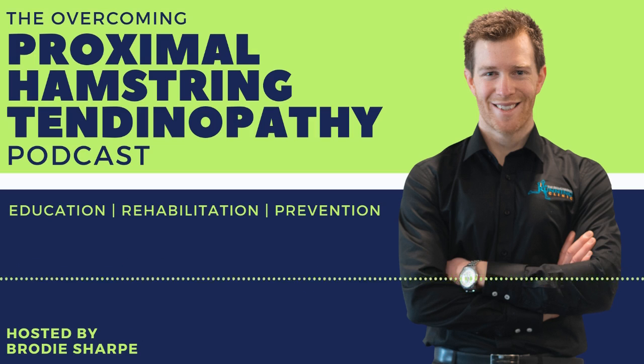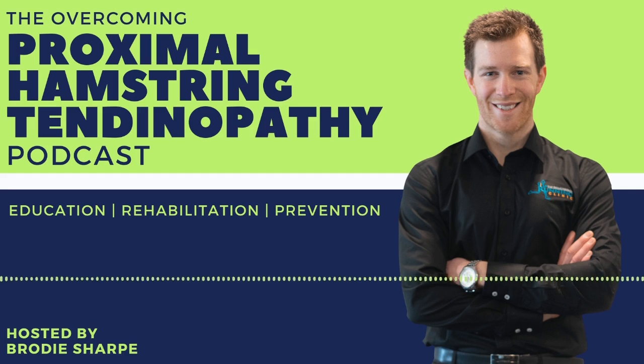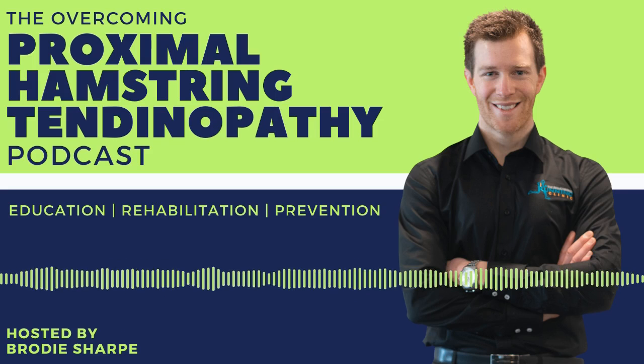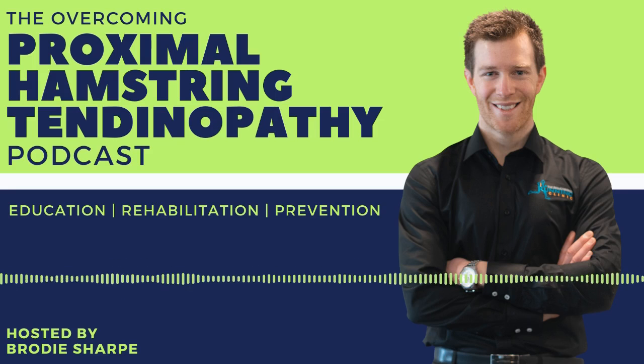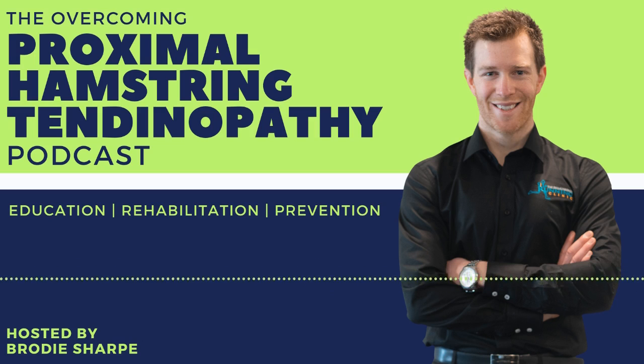And if it's very diffuse pain, poor sleep, other factors, then the last thing you want to do is give a Shockwave treatment, just make flare-up things. So the more and more I get experience, I'm more confident to say no to patients. I would say at least 30 to 40% of patients who come to me for Shockwave, I decline them because they come to me too late, or it's not appropriate, or they're quite weak.